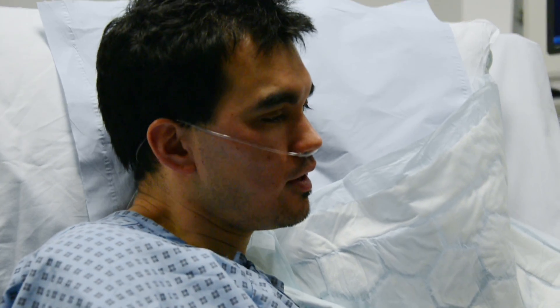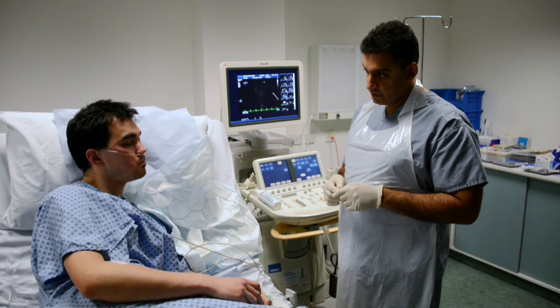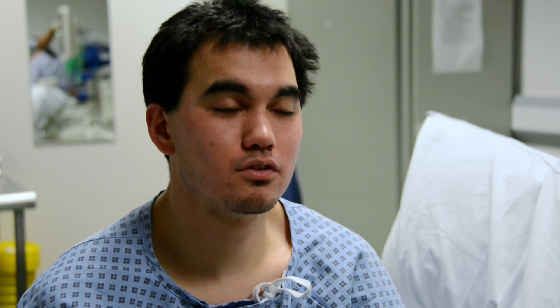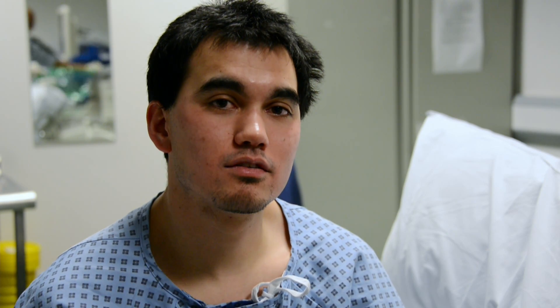The actual procedure was a lot better than I thought it was going to be. The prep and the spray — not so good. The probe coming out wasn't pleasant, but it wasn't painful. The result was as I expected. They suggested there was a hole in the heart, so it's not come as something completely out of the blue. It's unfortunate, but it's something I'll deal with, and it's good to get the confirmation.